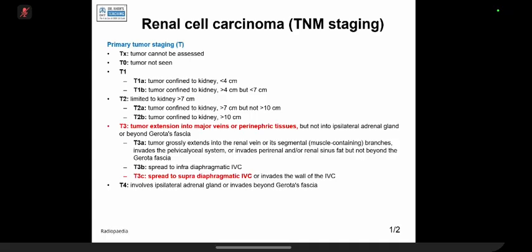Thank you. So the point is that I did ask you T staging, but then you started narrating I will look at the lung, I will look at this. You had already described that. I was asking you an extended question which was T staging. Though you were correct, I think it was not needed. The N staging, and you were again describing that I'll look at the lung, etc. So this is T3C, which you got right.